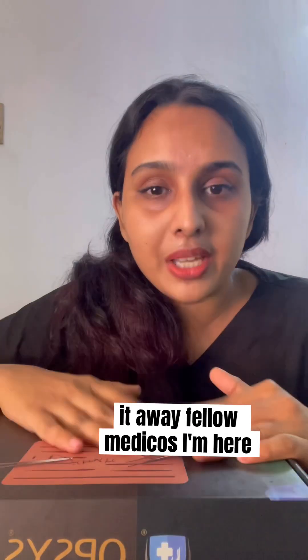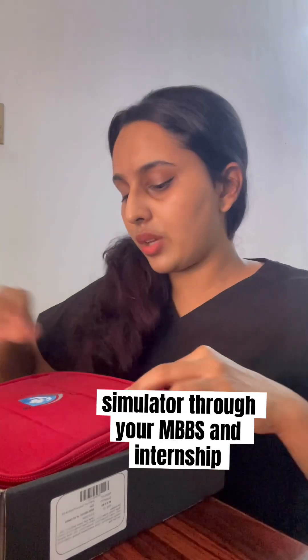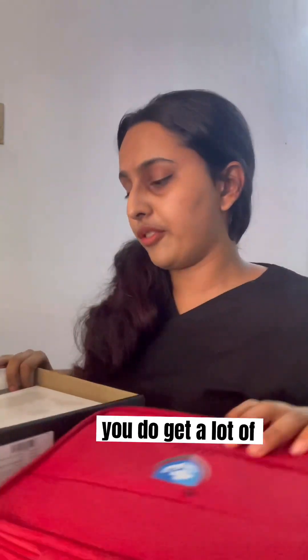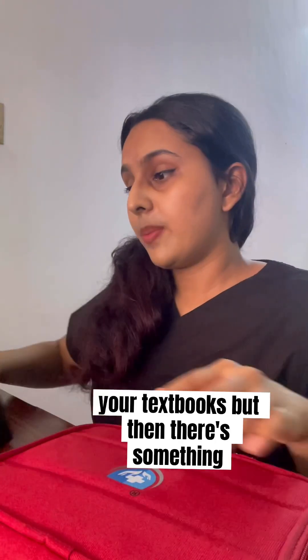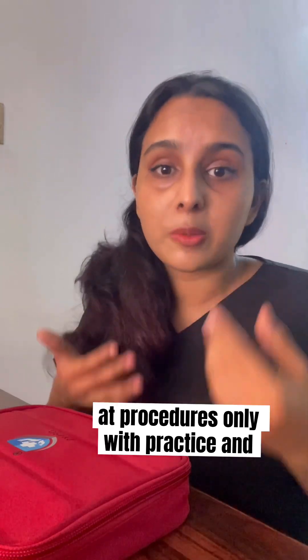Hello medicos, I'm here to introduce you to a suturing simulator. Through your MBBS and internship, you do get a lot of knowledge from your teachers and from your textbooks. But then there's something called procedures, and you get better at procedures only with practice.